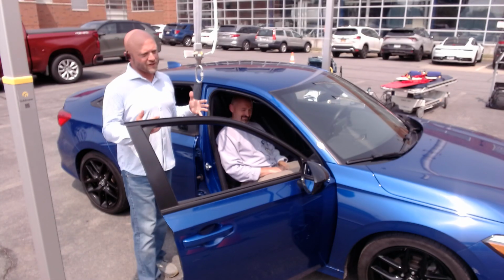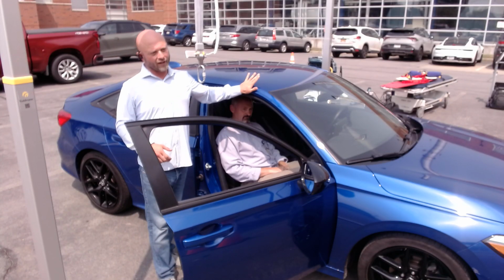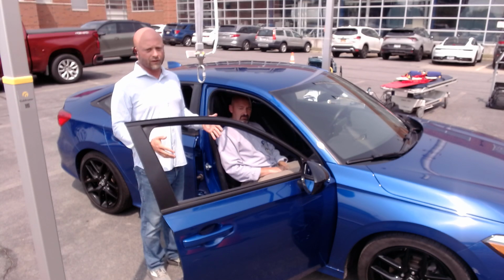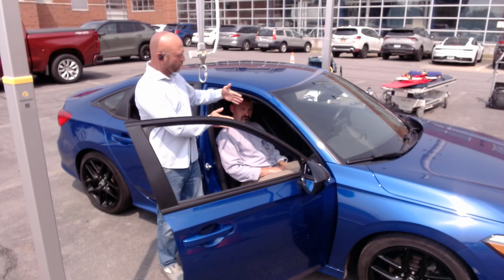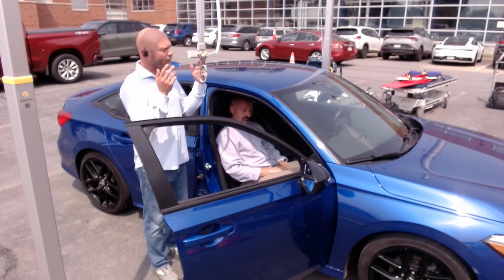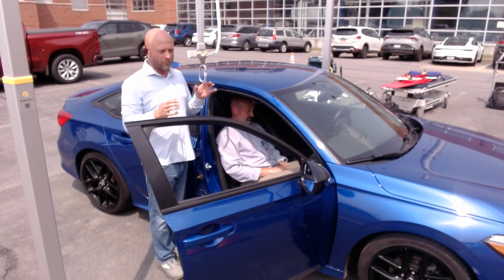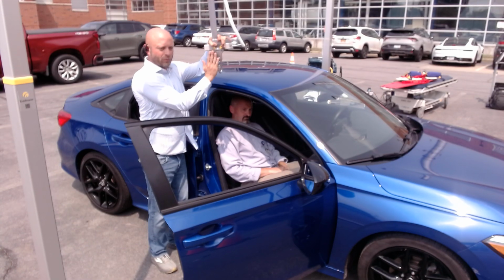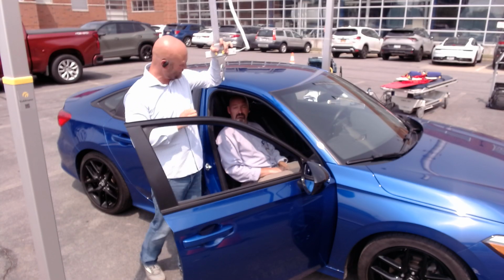All right. So when we're using a ceiling lift to pull a patient out of the vehicle, a couple of challenges are, again, we don't want to rub on the side of the car. So what ceiling lifts are designed to do is to keep the patient directly centered underneath of the sling lift. So when we're doing that car extraction, we want to have that little bit of an angle pull so we get that pendulum action to slide the patient out. So this manufacturer was able to make a device that we could lock the ceiling lift in place. So when we drop the sling bar into the car, we're going to be able to get that slight angle. So when we go to lift, it's going to pendulum them out of the car.